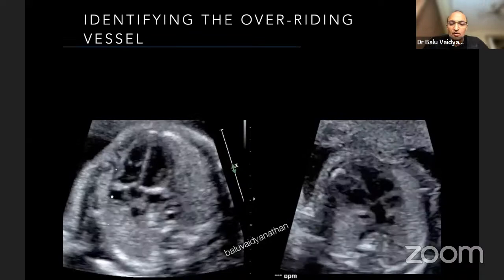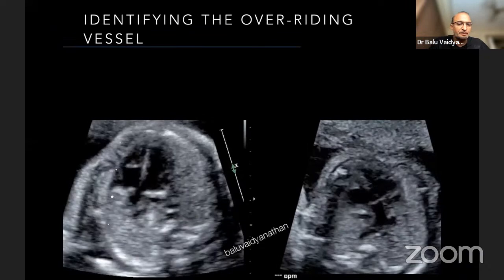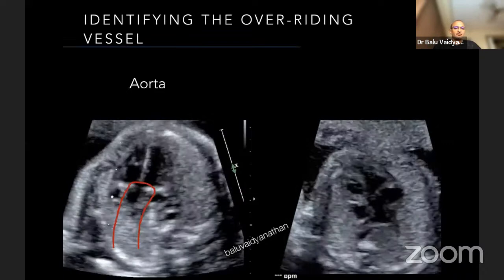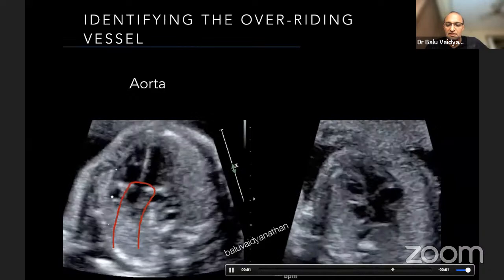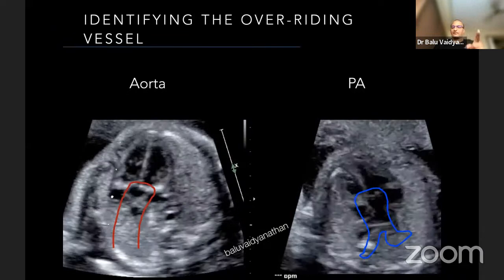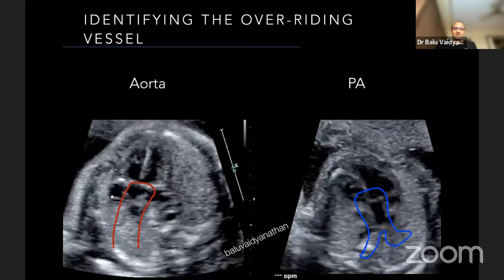The overriding vessel could be either the aorta or the pulmonary artery. In the first picture, the overriding vessel is not branching — it is a single vessel going straight, and that is an overriding aorta. In the second, the overriding vessel, if you look carefully, comes and you see a division — it's a bifurcating vessel, so that is an overriding PA. Something new today: not all that overrides is the aorta; the PA can also be overriding.